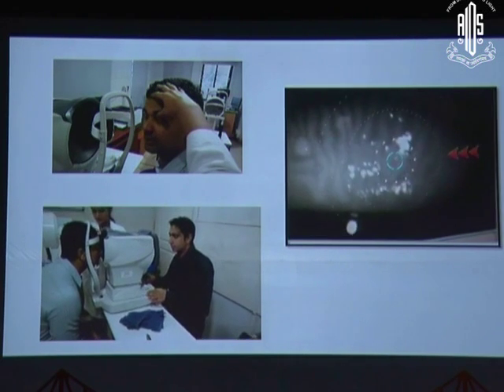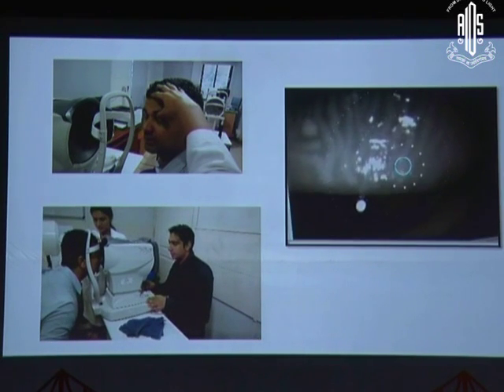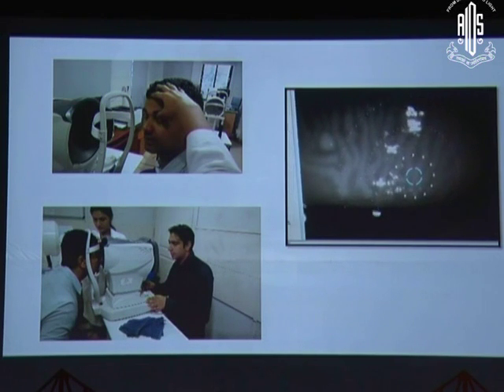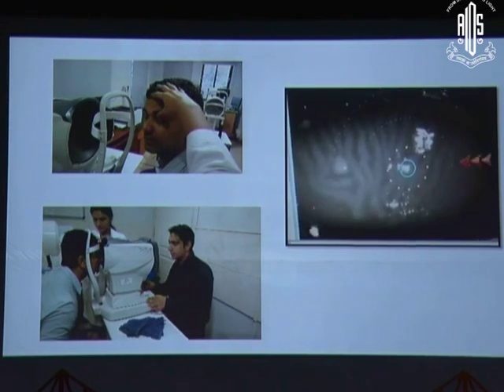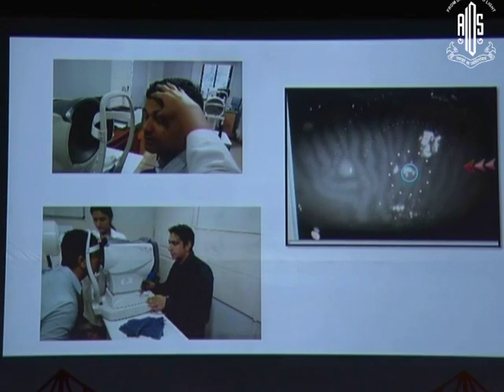And what you see here is not on a keratograph but on your abrometer. The same thing can work over your autoref as well. It does not capture the image, but it grossly helps you screen and understand if the patient has any anatomical abnormalities in the meibomian glands.